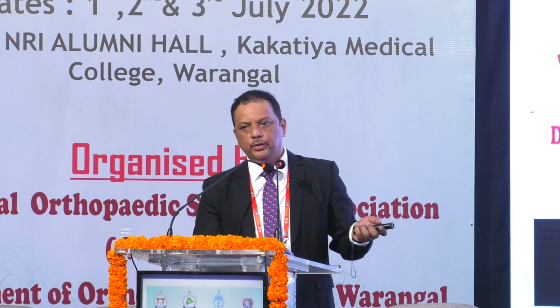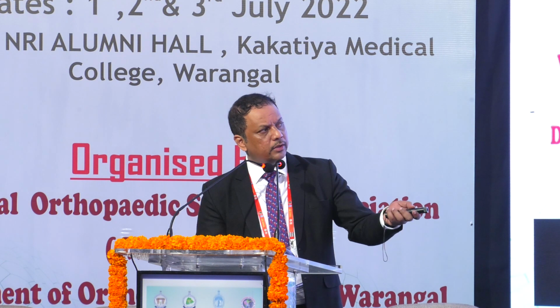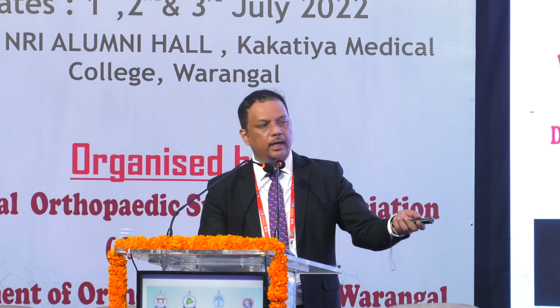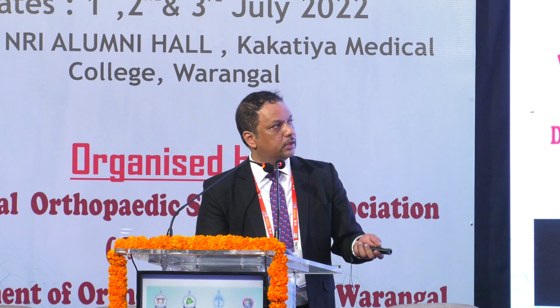Fixators, we should know when to use them, right? Excessive distraction like this definitely is a recipe for stiffness and CRPS. So you look at how almost twice the amount of radiocarpal space, that is your guideline. A normal radiocarpal space is about 2 millimeters, and this is twice that. If you are distracting too much just to get the reduction, it's definitely not worth it.